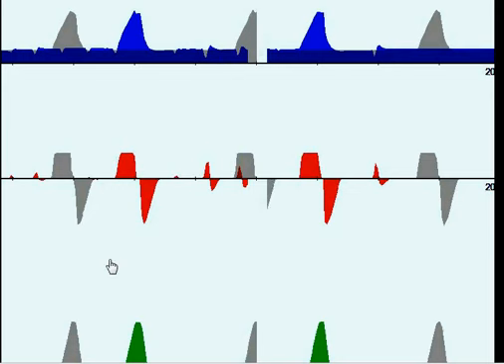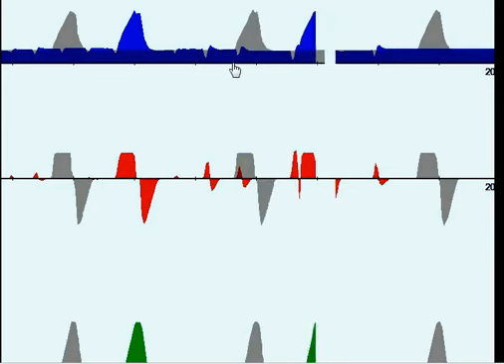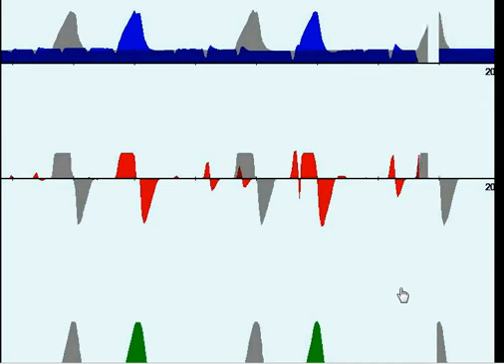It's more obvious with this set of waveforms, my spontaneous breaths in between my mandatory breaths, and how they look totally different than my mandatory breaths, which were for a fixed volume and a fixed inspiratory time.